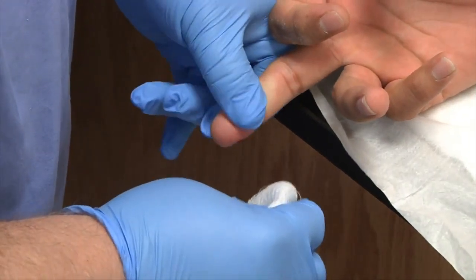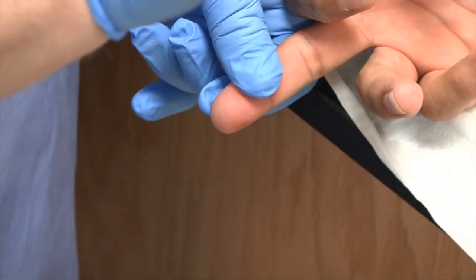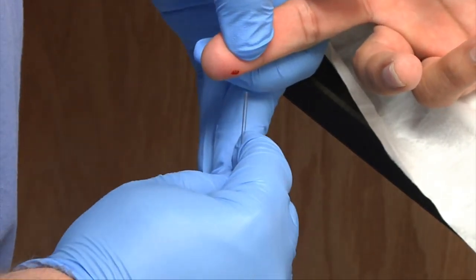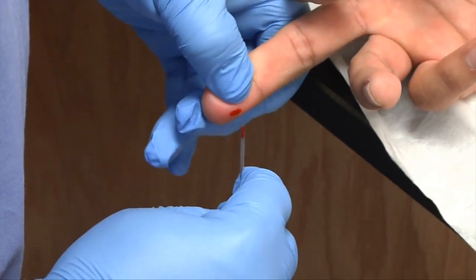Squeeze. Wipe away the first drop of blood. With your capillary tube, red line facing down, go ahead and collect your sample. You'll try not to touch the capillary tube to the patient's skin — just dab on the bubble of blood.